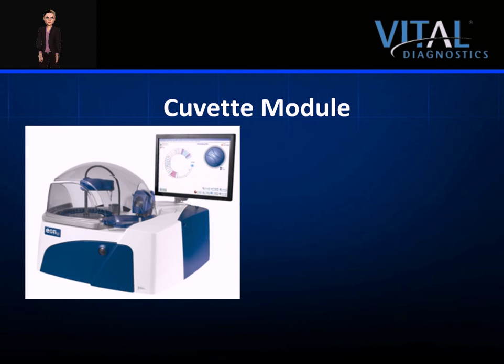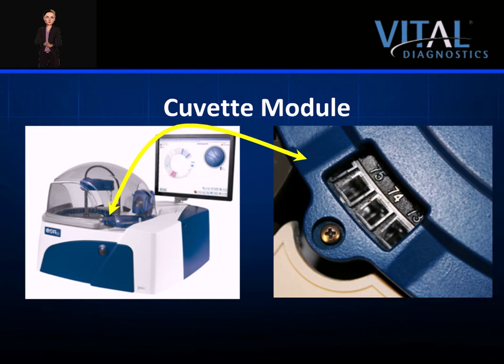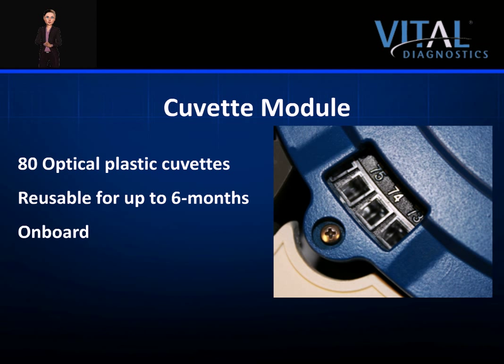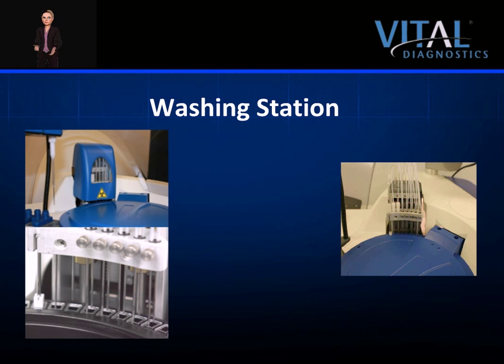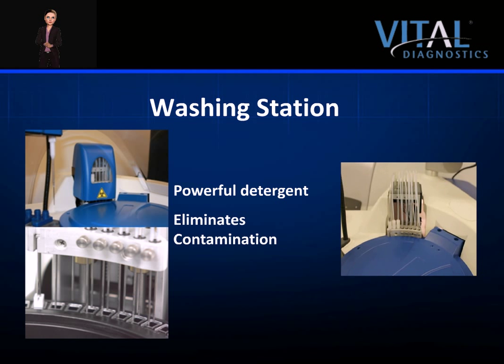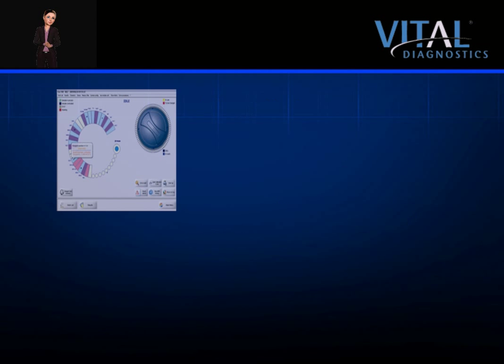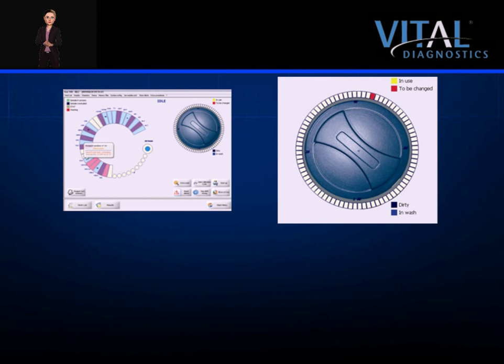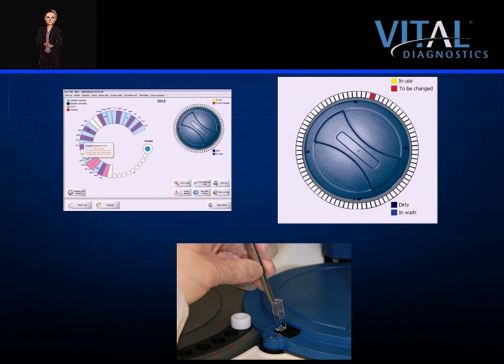The EON100 cuvette module is located under the round blue cover on the top right side of the analyzer. The module houses 80 reusable cuvettes manufactured of optical plastic. The cuvettes are reusable for up to 6 months and automatically washed on board with a powerful detergent, then dried completely. Proper washing eliminates carryover and contamination. Each cuvette is automatically checked and verified by internal optics. If a cuvette fails an optics check, it is re-washed and re-checked; if it fails again, it is flagged and avoided by the software. Cuvettes can be individually replaced with the special tweezers supplied with the instrument.